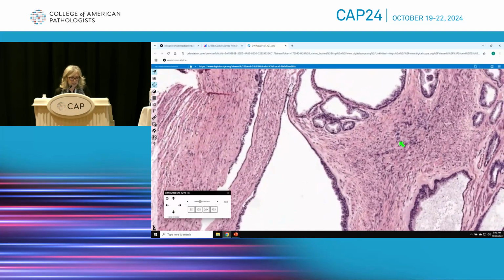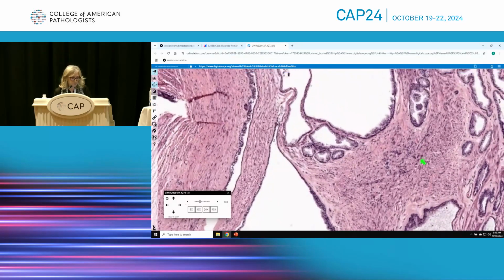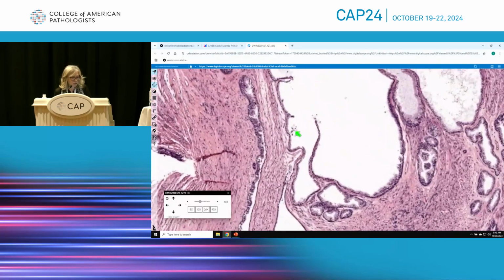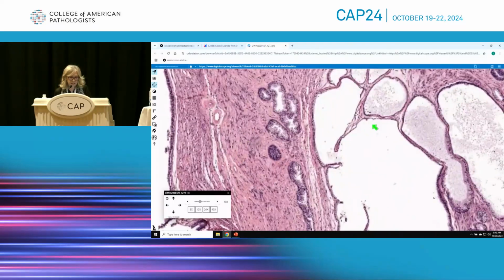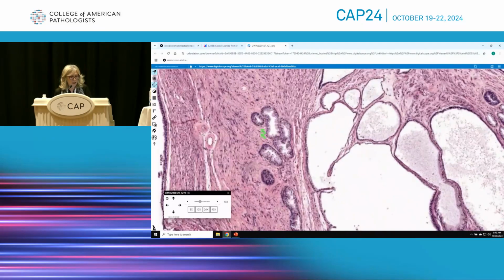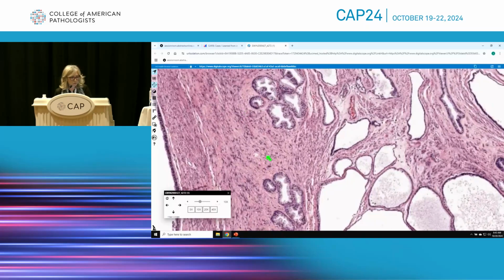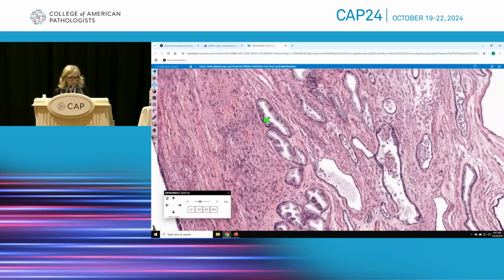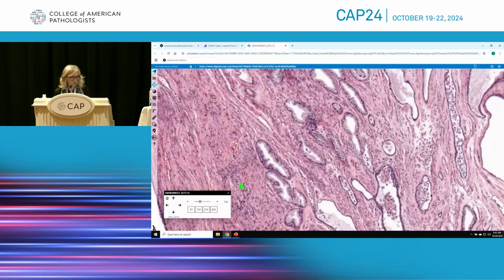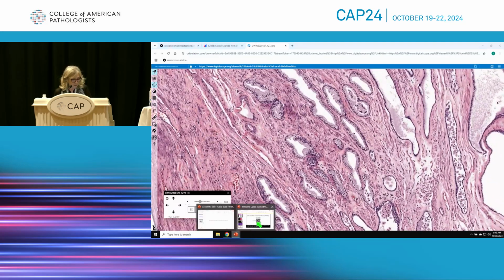If you looked at, I think it's not yet in focus. Oh, there you go. If you look at the stroma, it looked to me like prostatic stroma after all, not particularly hypercellular, because one of the first things that triggered was, and I will let you do the differential, but I thought of a stromal tumor. And I just want to show you that, I'm not going to spend too much time on this, that the whole lesion looked like this, with something that looked to me like prostatic stroma and benign glands. So if we go back to the presentation.